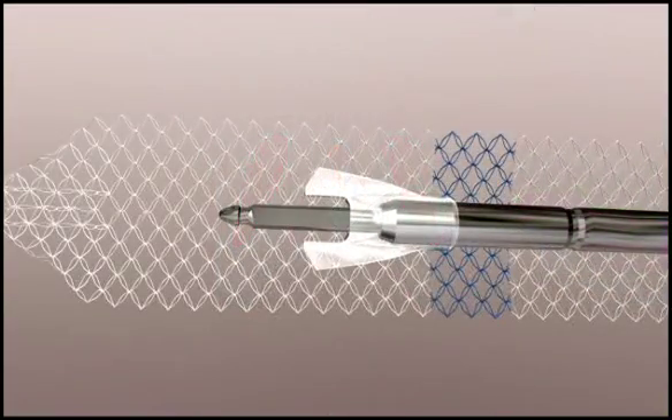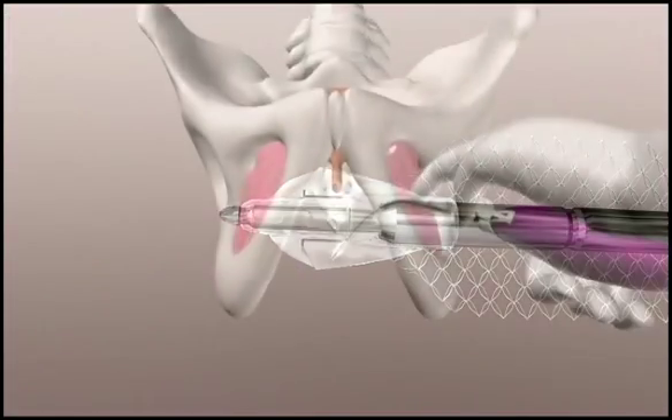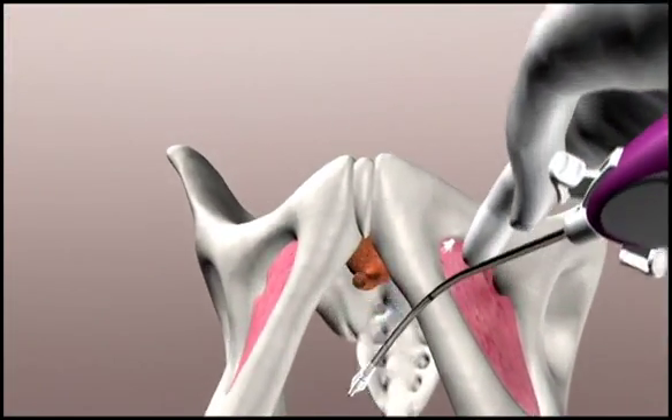Load the second sling tip onto the needle. Place the sling tip on the patient's opposite side.